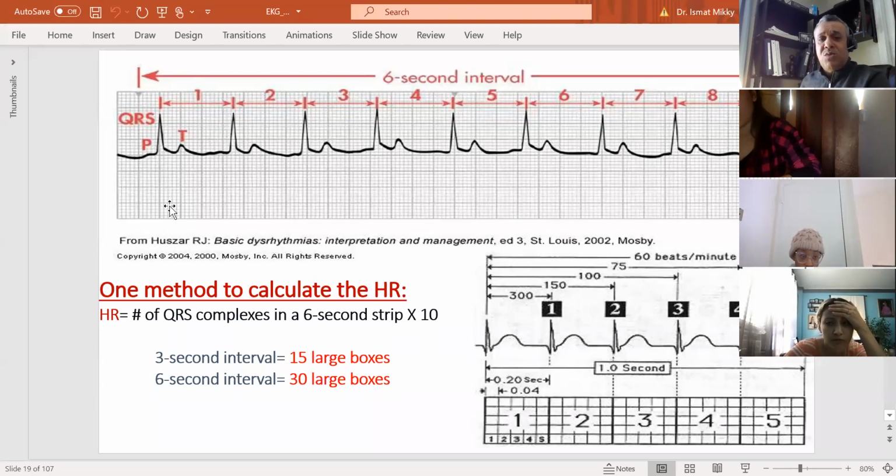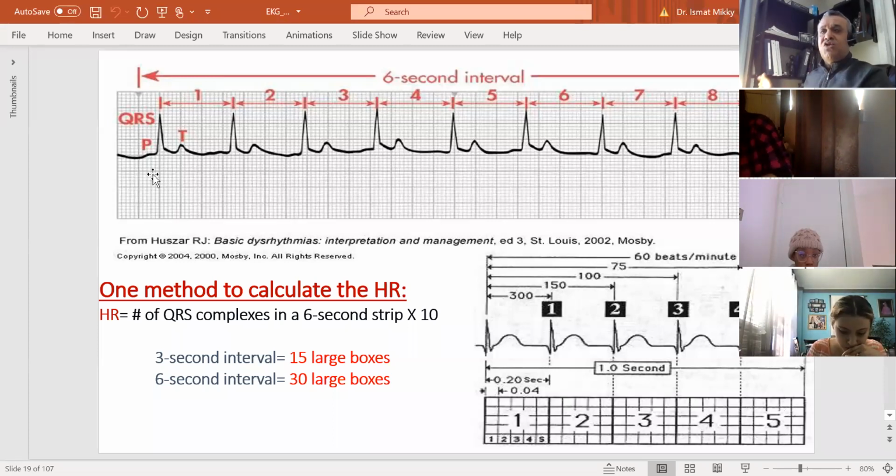If you overlook this step, the answer is going to be incorrect and wrong. Because the EKG strip, especially when you print it out, I can give you an EKG strip of 5 inches long. And if you keep printing, you will have it like 50 feet long.